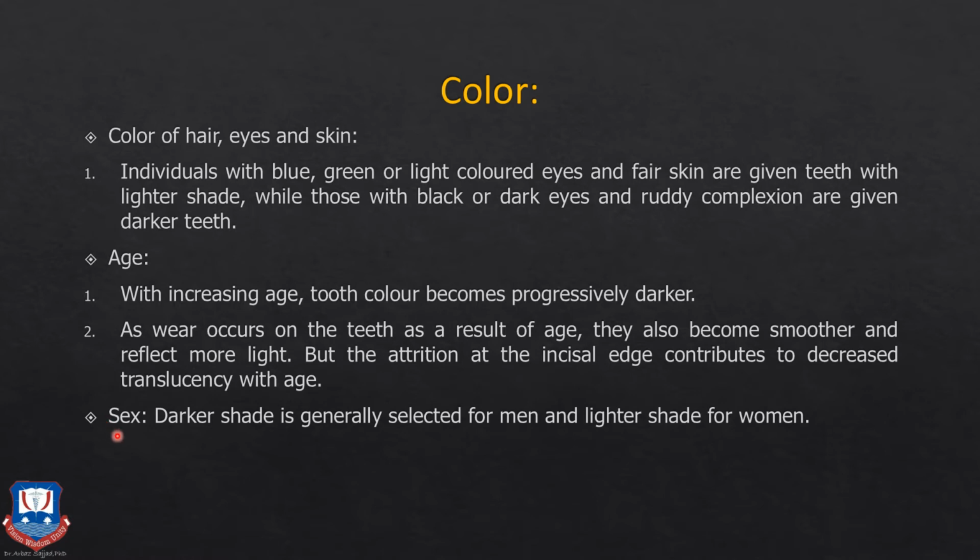The sex again will determine. For males we generally prefer a darker shade, whereas for females we prefer to give them whiter shades, because it is the general preference of females also.